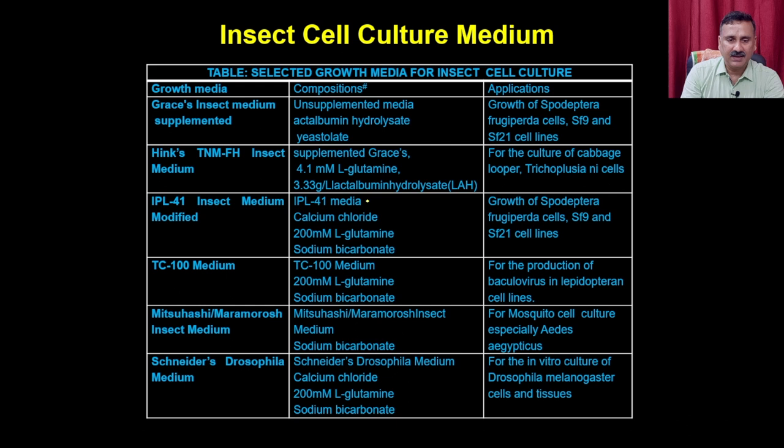Apart from that, you can also use the insect cell culture media, and this is the recipe I have provided, and the media preparation method and everything is almost the same as what we have discussed.